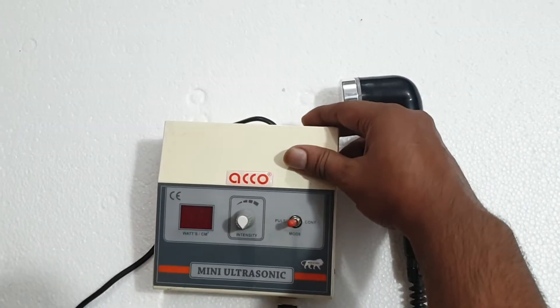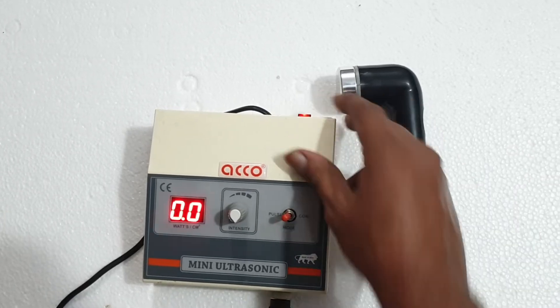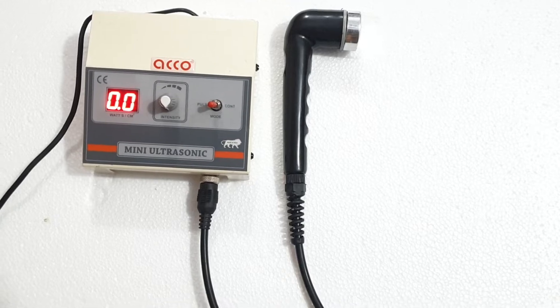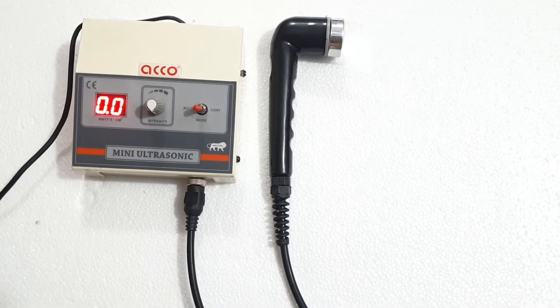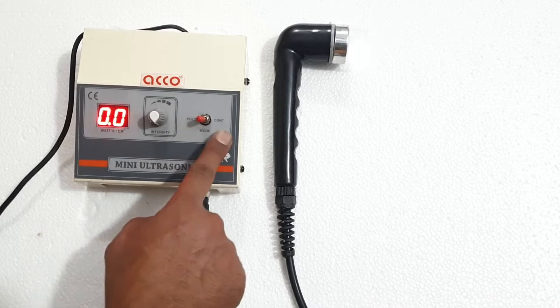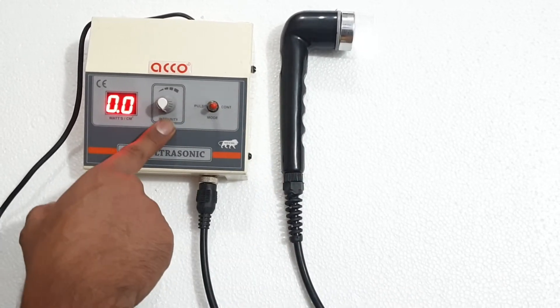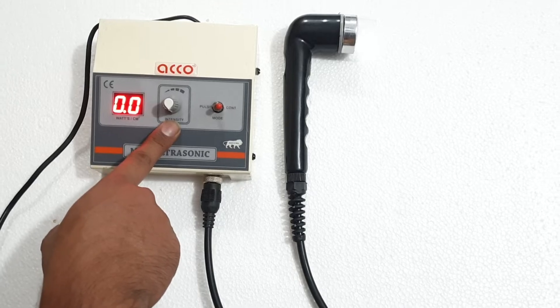Attach the handle and wire. Switch on the machine. Now we will start the water testing of the machine. Select the mode — pulse or continuous. This is the intensity knob to increase and decrease the intensity.